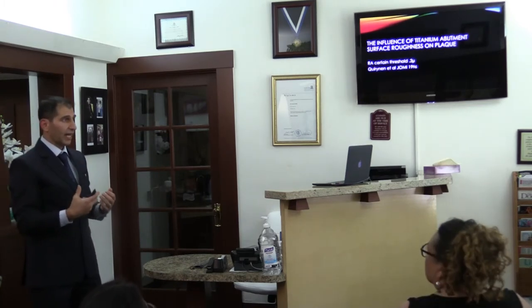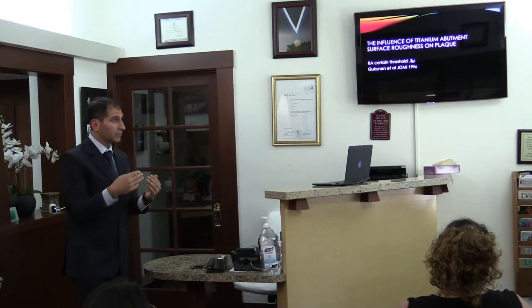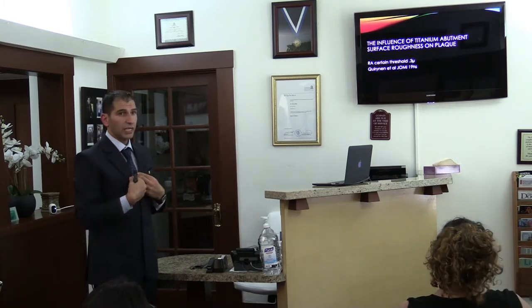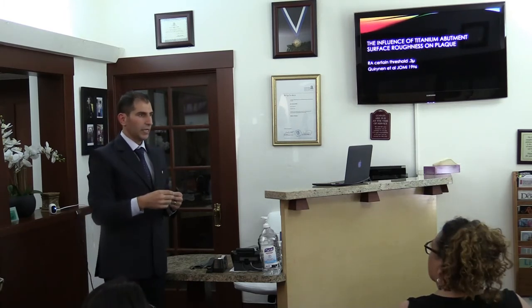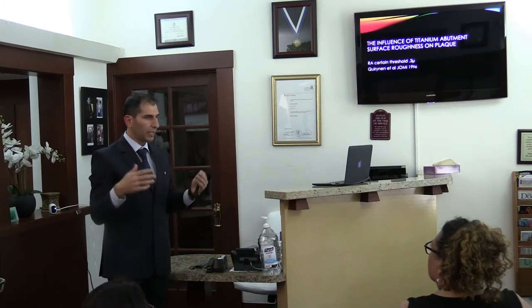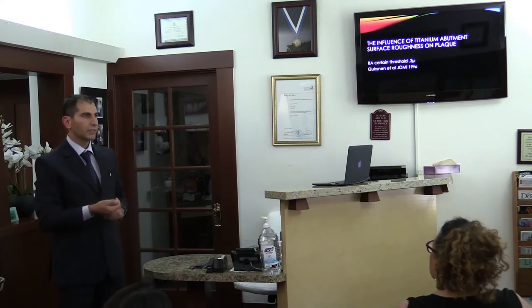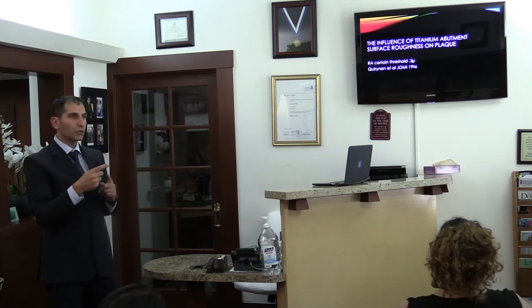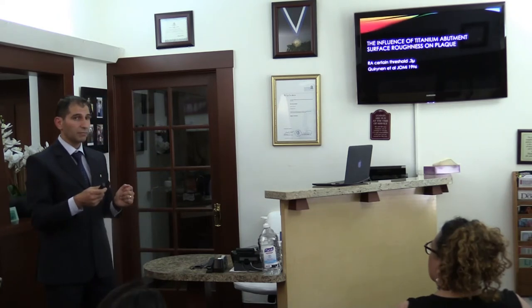Actually, I'm very happy that we have a dental abutment available commercially for us to use, so that we can get some type of functional fiber insertion around dental implants. But my concern is, even with my good patient with good oral hygiene, life is up and down, and sometimes they get into a situation where there's a family emergency, they get sick, something is going on in their life, and they ignore their hygiene. So my concern is that 8 micron is very rough. I know probably the hygienist will agree with me: a rough surface on a dental abutment is hard to control plaque on, hard to clean.